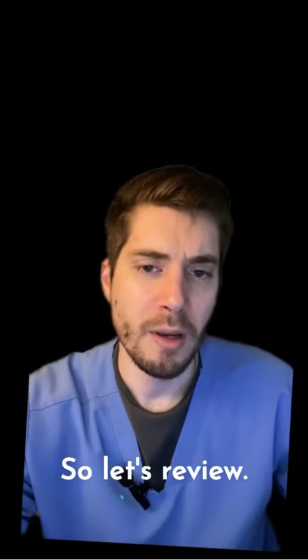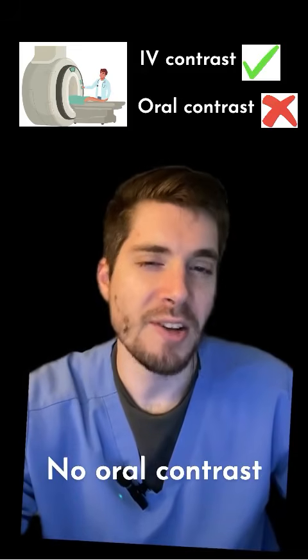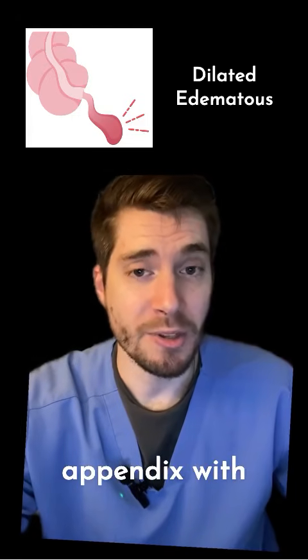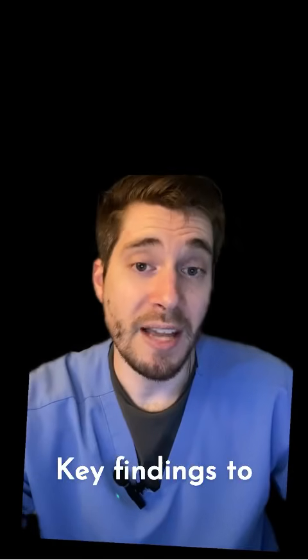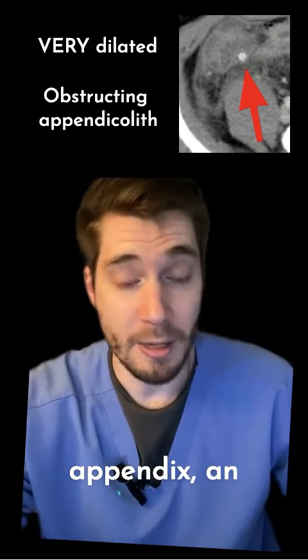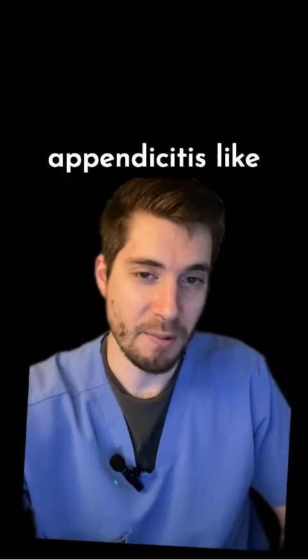So let's review. You're concerned about appendicitis. What should we order? CT abdomen pelvis with IV contrast. No oral contrast necessary. What should we look for? A big dilated appendix with surrounding edema in the fat. Don't forget to compare the fat around the appendix with normal fat elsewhere in the abdomen. Key findings to identify for our surgical colleagues: a very dilated appendix, an obstructing appendicolith, or free air or signs of abscess formation. Now you can evaluate appendicitis like a radiologist.